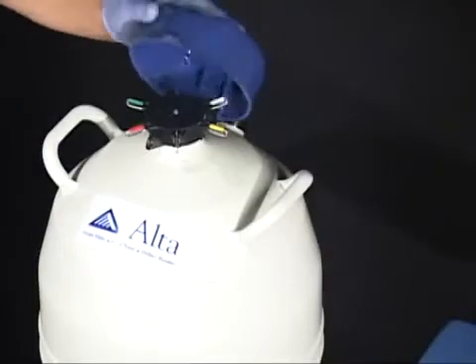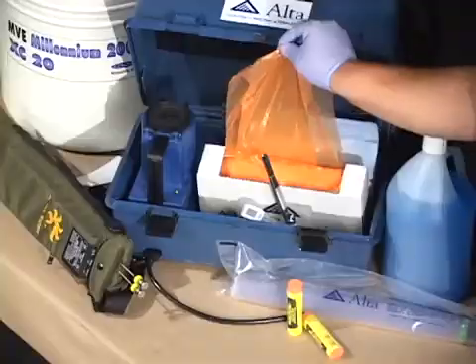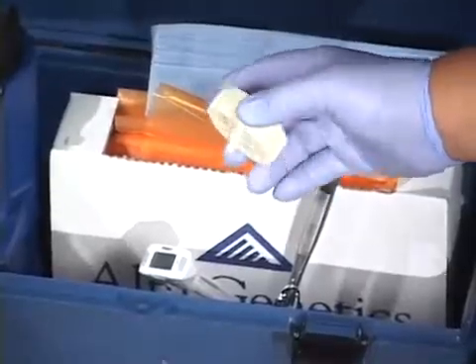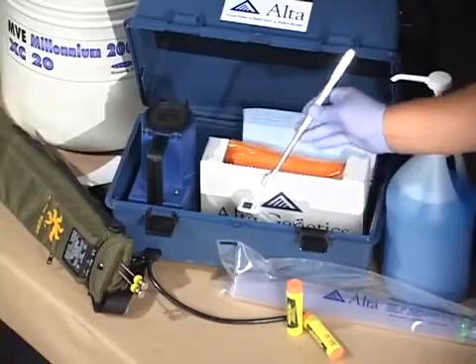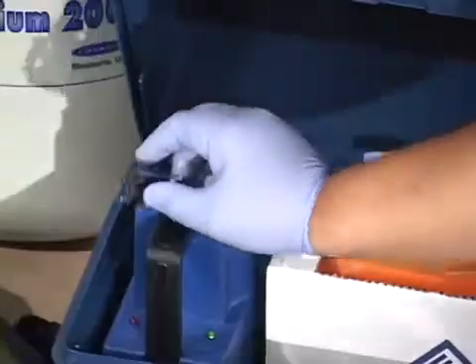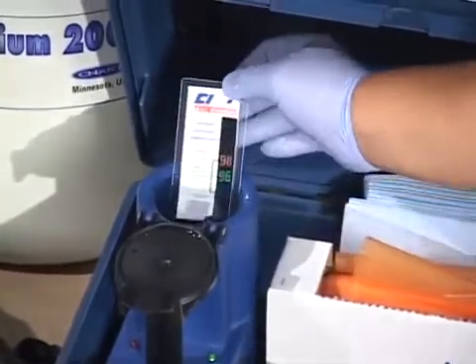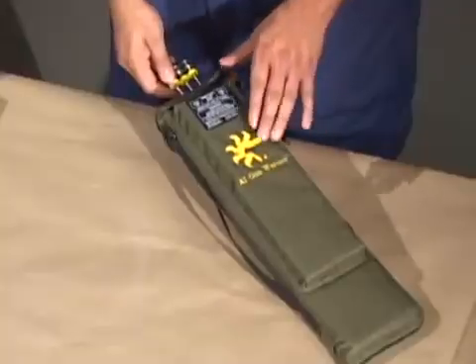The required equipment includes: a storage tank, AI gun, disposable plastic gloves, straw cutter or scissors, tweezers, lubricant, paper towels, semen thawing unit with thermometer, disposable plastic sheets, and a gun warmer.